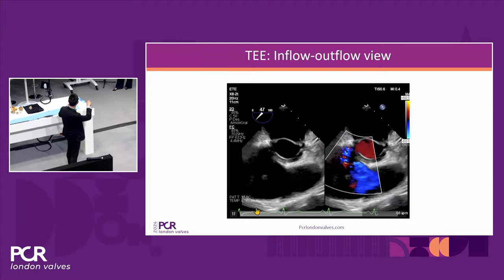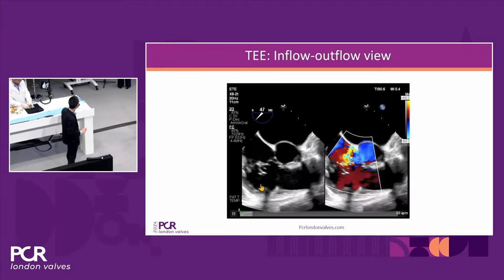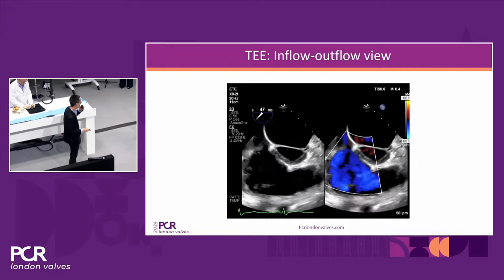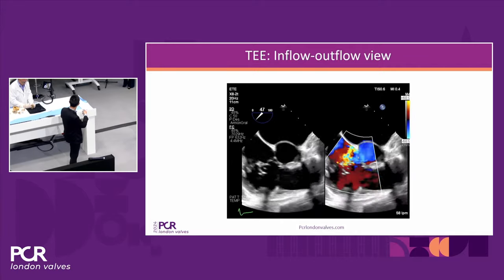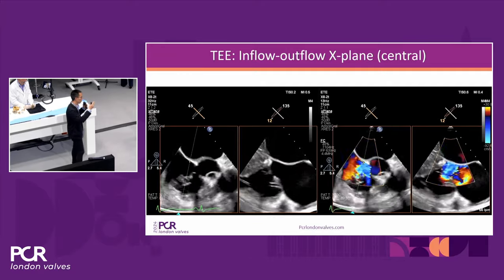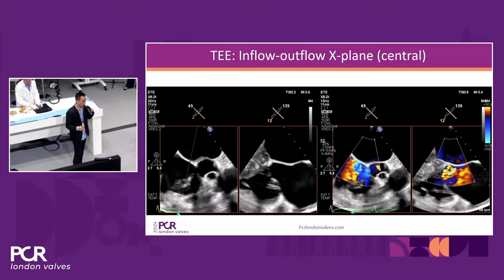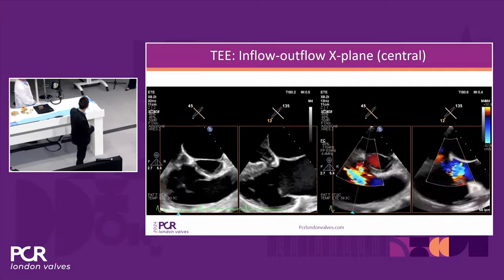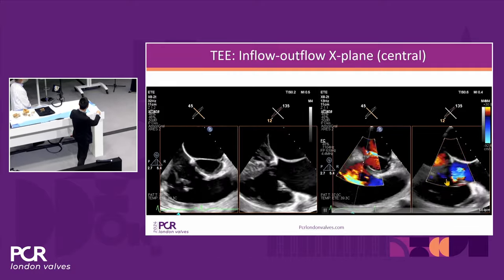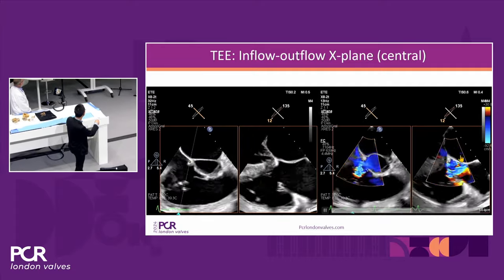The anterior part of this valve is the anterior leaflet, and the posterior part of this valve is the posterior leaflet. So our jet originates in the center of the valve, just in the center of the papillary muscle. So systematically, we use the X-plane moving from the center to the anterior and to the posterior part of the valve to check where the jet is. This is in the center of the valve. We can see in the color view how the jet is eccentric toward the septal part of the right atrium.